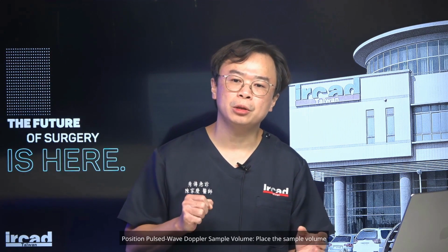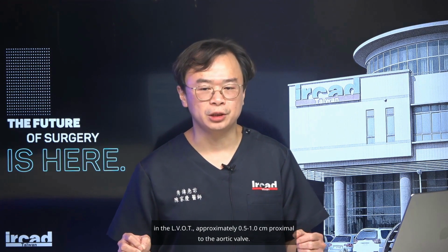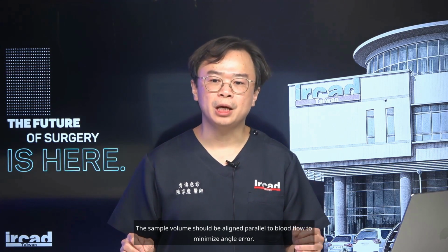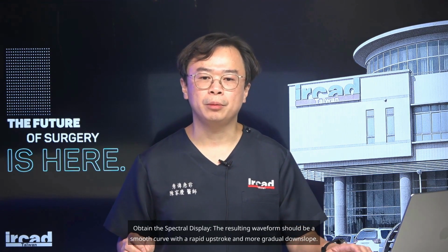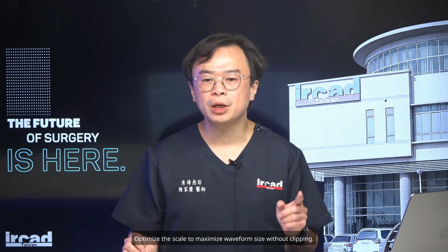4. Position pulsed wave Doppler sample volume. Place the sample volume in the LVOT, approximately 0.5–1.0 cm proximal to the aortic valve. The sample volume should be aligned parallel to blood flow to minimize angle error. 5. Obtain the spectral display. The resulting waveform should be a smooth curve with a rapid upstroke and more gradual downslope. Optimize the scale to maximize waveform size without clipping.